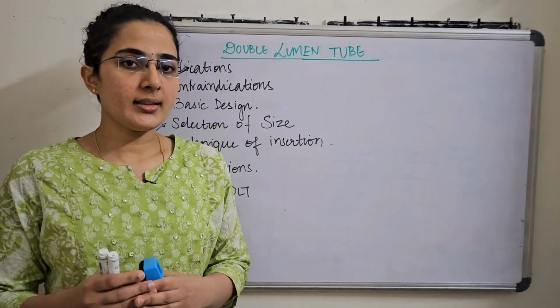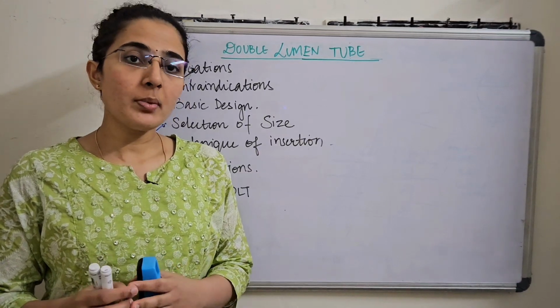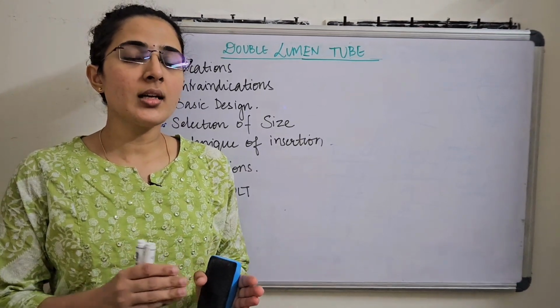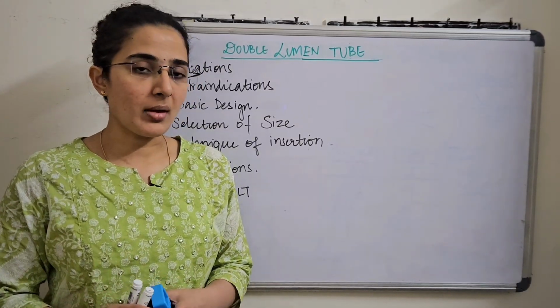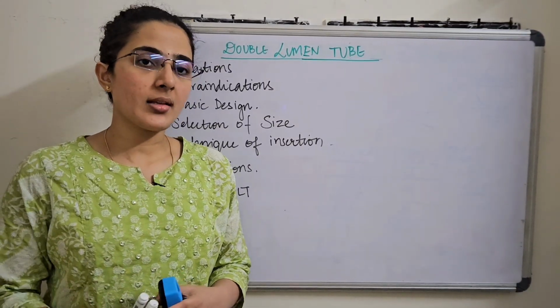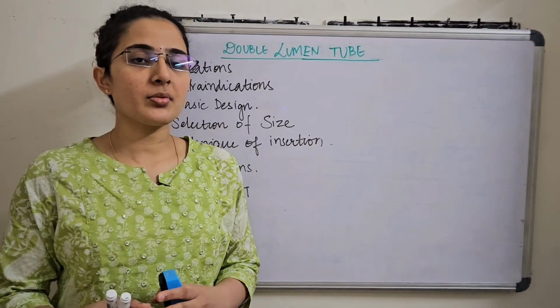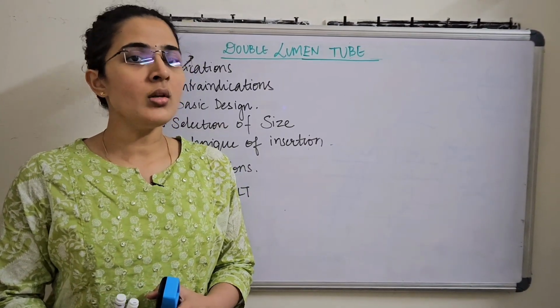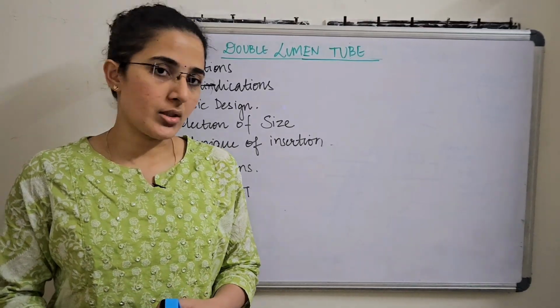We should also ensure that the stylet is inserted into the double lumen tube and is not protruding too much out of the bronchial end, otherwise it causes airway trauma. Good lubrication has to be applied, and we also have to check the volume to which the cuff gets maximally inflated, and check for leaks or any external damage.